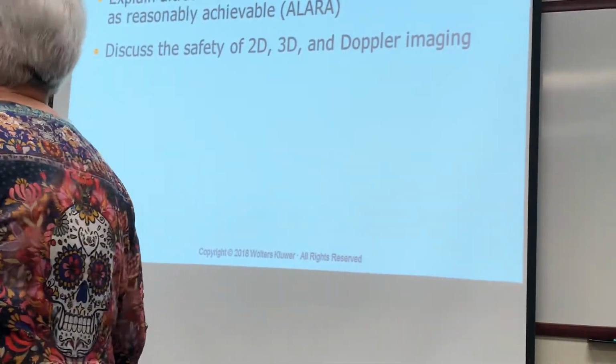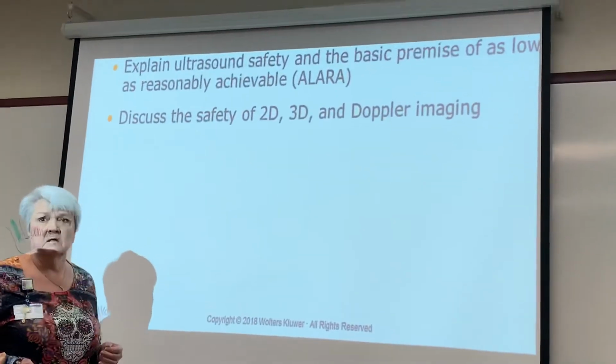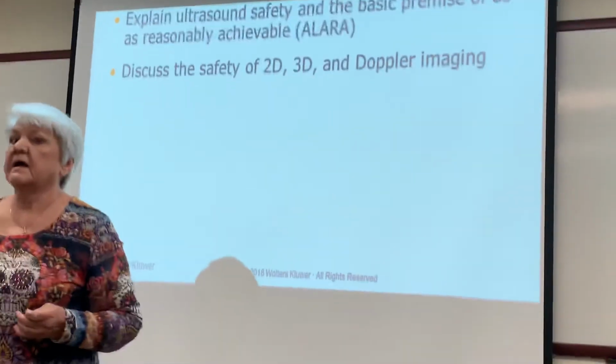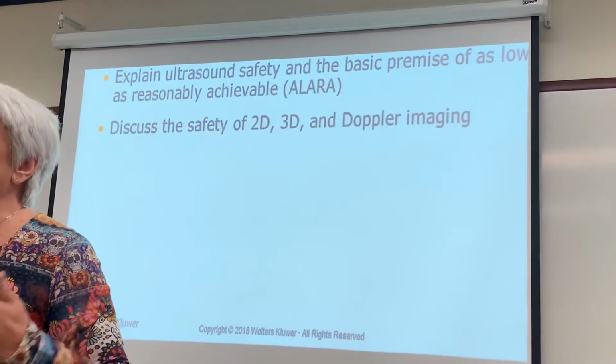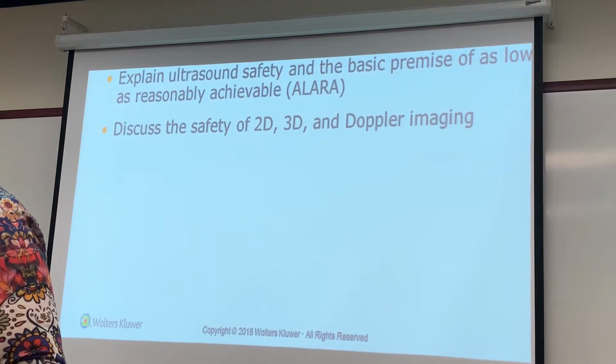Now, y'all remember what ALARA stands for? As low as reasonably achievable. Okay. Do not put more energy onto this fetus than is necessary.